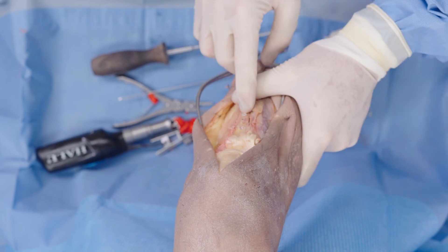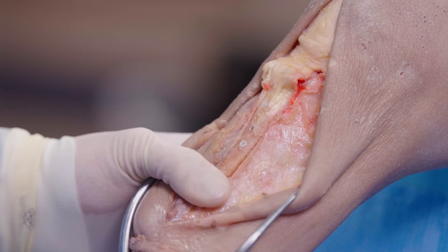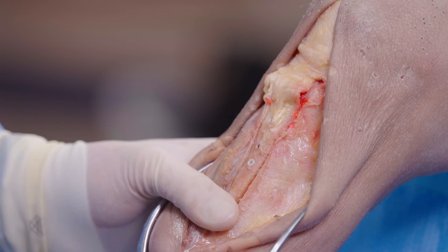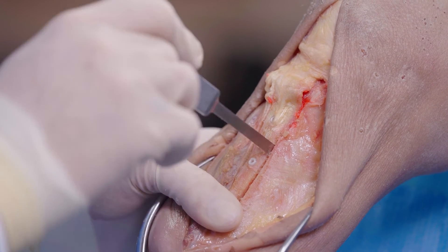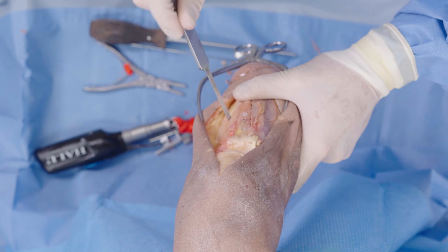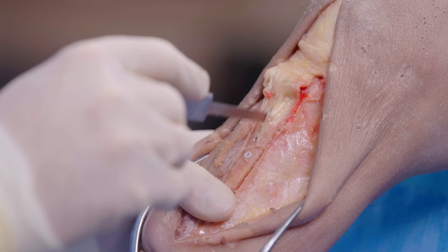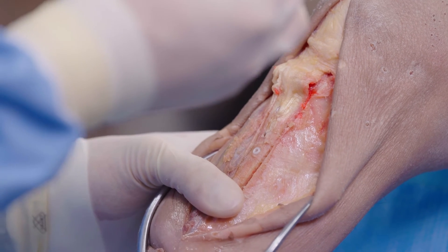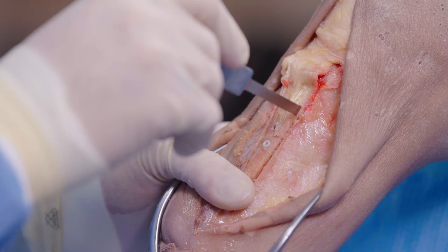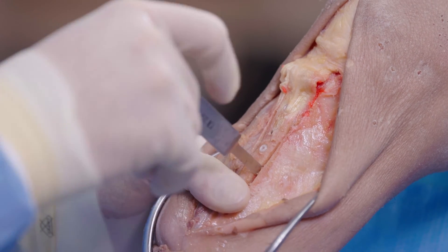You can see that we are countersunk with our osseo screws, and this has great compression. If I try to pry the osteotomy out, I cannot — we've got great compression here. One of the fun things you're going to see is on your post-operative films, you'll be able to see the osteotomy site but you won't be able to see any metal screws. This has been my absolute go-to.